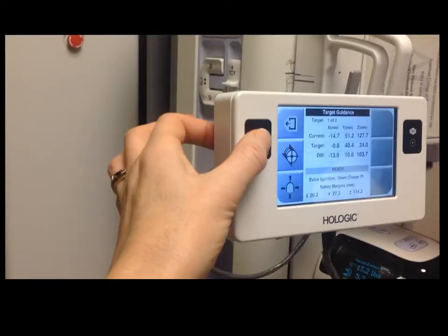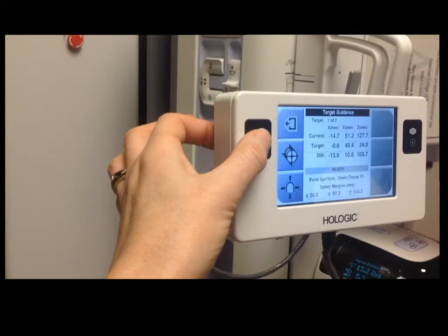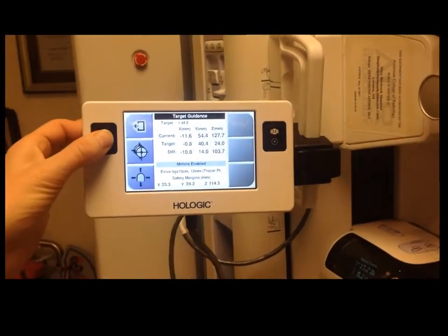Before the gantry is moved, read the coordinates of the target out to the technologist and have her out loud confirm those with you. The gantry is moved to the coordinates by pinching both the front and the back buttons here at the same time. You can do it on either side of the display unit here. Here we can see those changes.